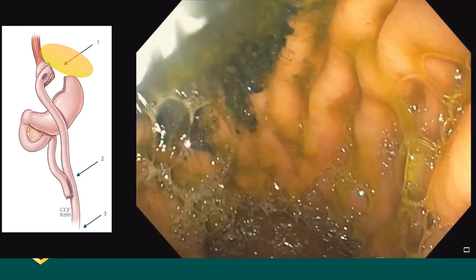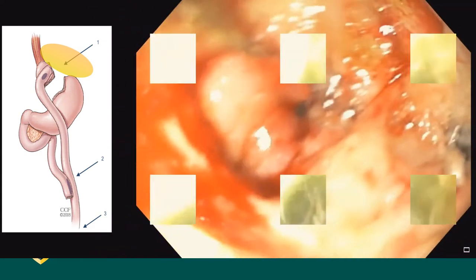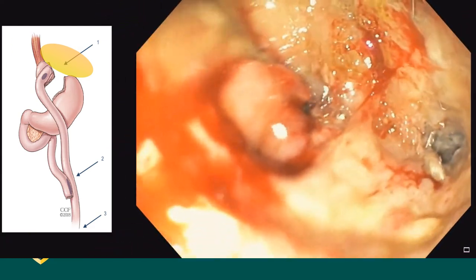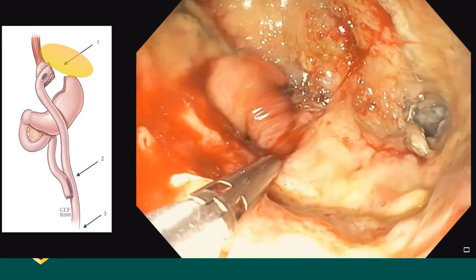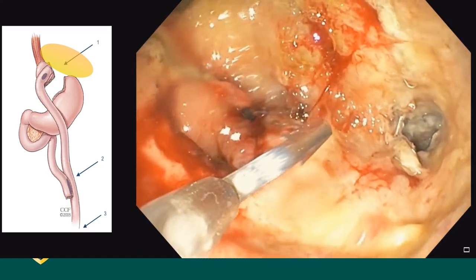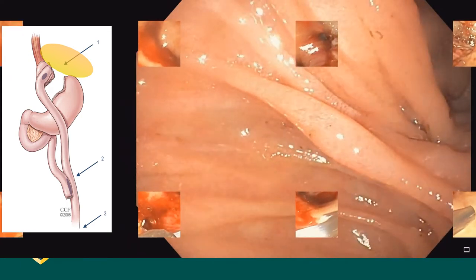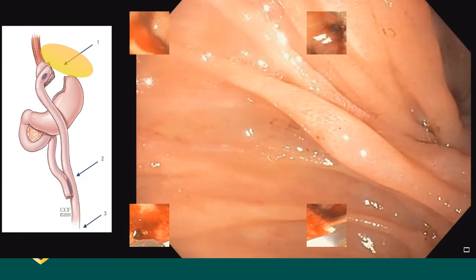That's the remnant stomach. It's a small opening. I initially decided to clip it — I brought the clip but it wasn't the right size. I considered an Ovesco clip, but then it came to me: this opening was on the most dependent area of the contained cavity, so whatever fluid accumulates there can drain down into it. I aborted the clipping and just left it open, continuing with endovac therapy.